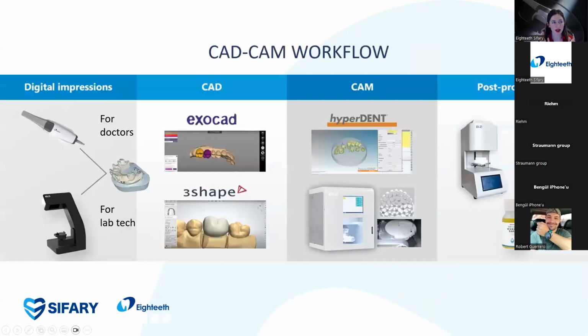Okay, about CAD/CAM workflow, you should keep in mind digital impressions, it starts from the beginning. It could be easier for doctors if they use intraoral scanners such as Helios 500, yeah? And they can send to the laboratory, who can design, mill them out, and post-process.